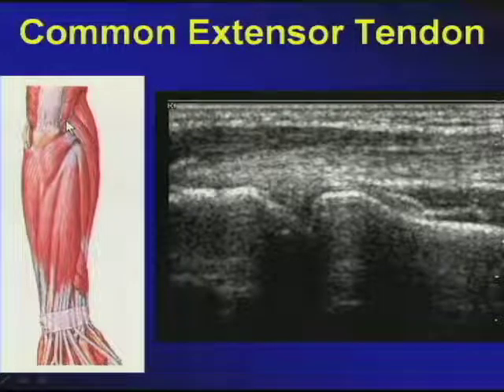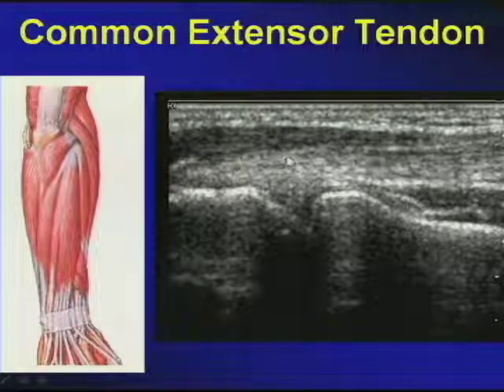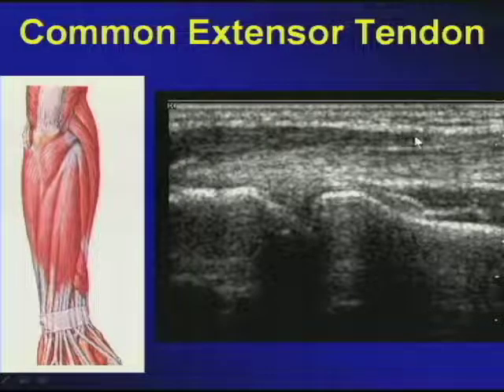On grayscale imaging of ultrasound, you'll appreciate the bone acoustic landmark of the radial epicondyle, the joint space, and then you see the radial head with a radial neck, and of course, one more time, a minimally and physiologically distended annular recess. Now, you could also appreciate that there is a fibrillar pattern inserting on the radial epicondyle, representing the insertion or conjoint tendon of the extensors. Around that is the relatively hypoechoic multipennate structure of the muscles.